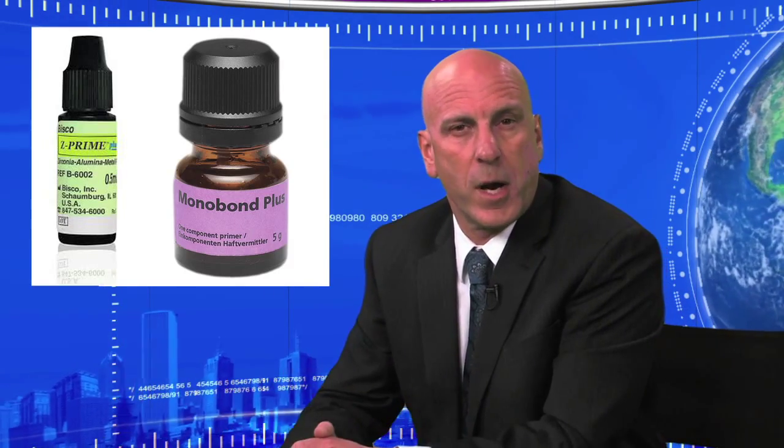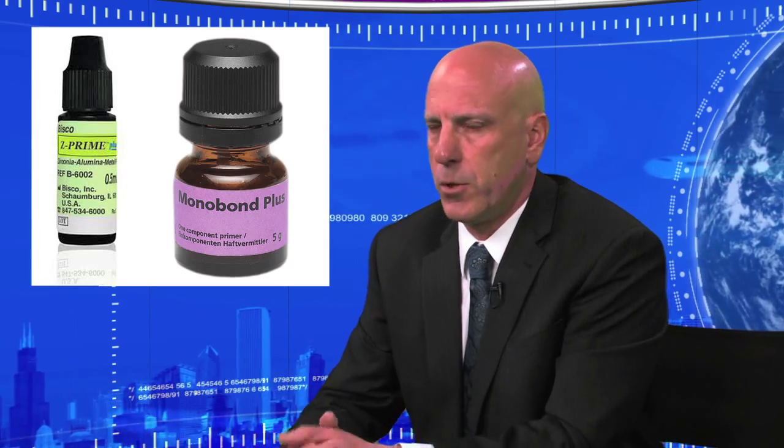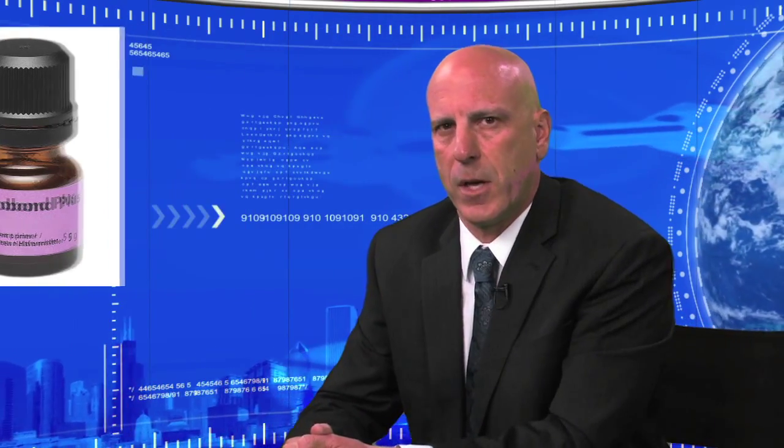And the best two choices are going to be Z Prime Plus from Bisco or Monobond Plus from Ivoclar Vivadent. Both of these products are zirconia primers. They're really not silanes like we typically think of, even though they do the same thing. They're going to help the cement bond to the crown.